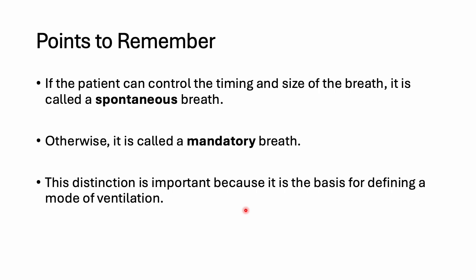We have positive pressure ventilation. Okay, someone who is not able to breathe on their own, or needs help to breathe on their own, will be put on mechanical ventilation. And the mechanical ventilation can be either invasive or non-invasive. Invasive means the person has been put on an artificial airway, which you have covered in Meredith's lecture, or non-invasive when it's delivered through a face mask.